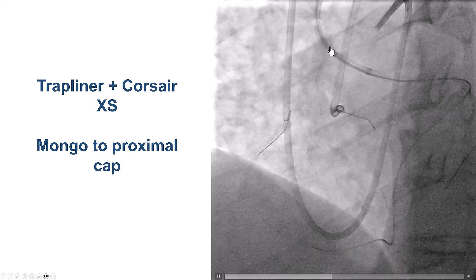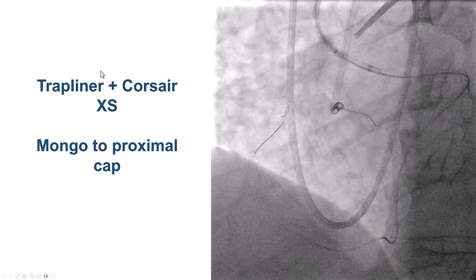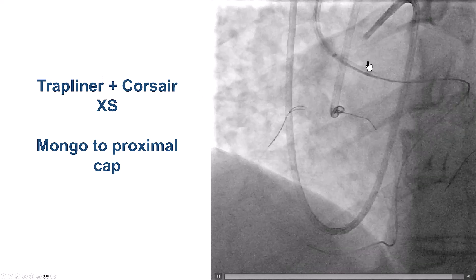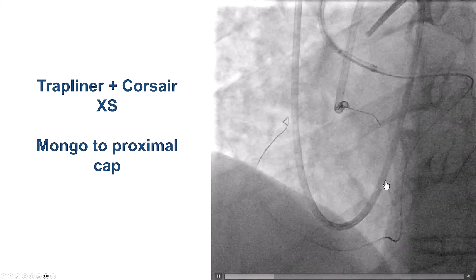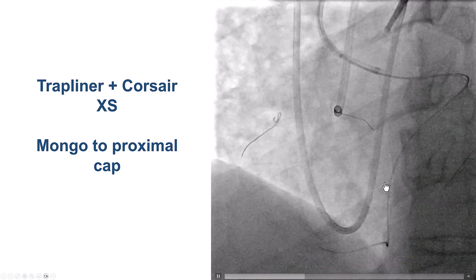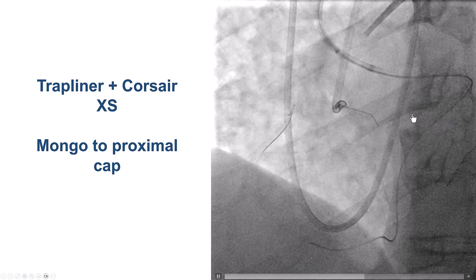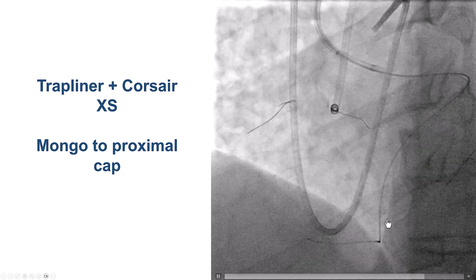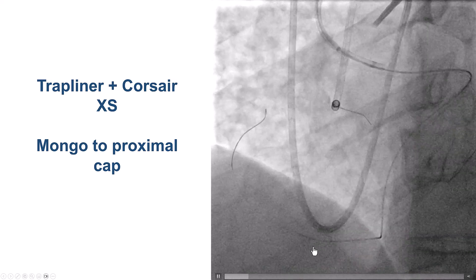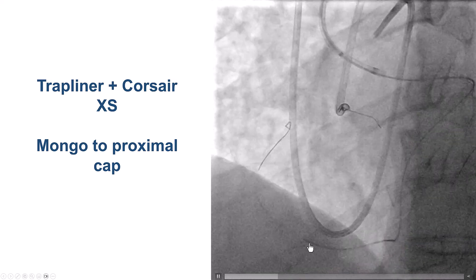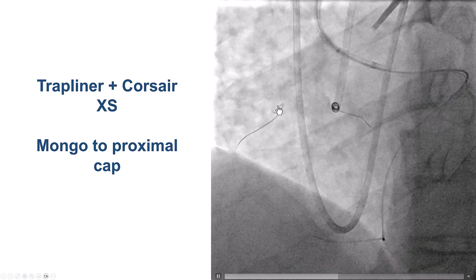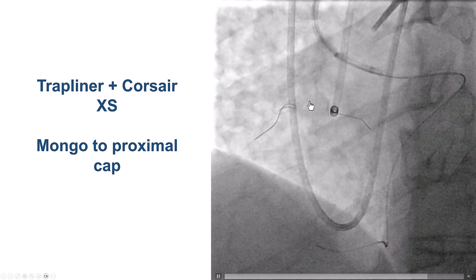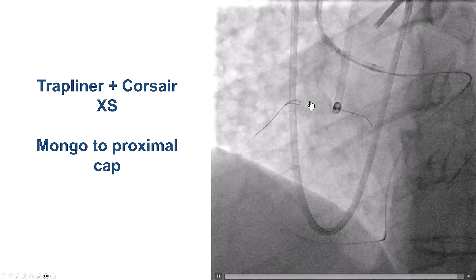In cases like this, one of the first actions is to use a guide extension — we used a Trapliner — and then switch to a different microcatheter. We used a Corsair XS, which can be torqued. By doing this, we were able to advance the microcatheter all the way to the distal right coronary artery, and then advance the Gladius Mongo wire retrograde, close to the proximal cap.